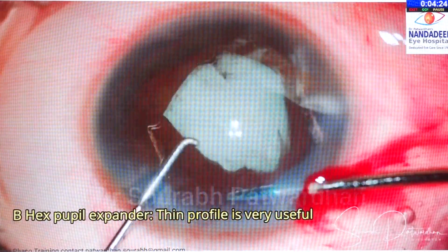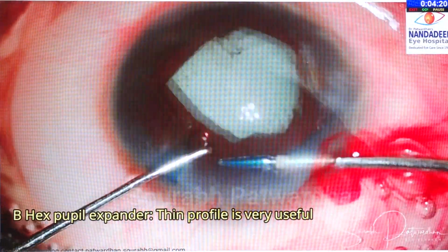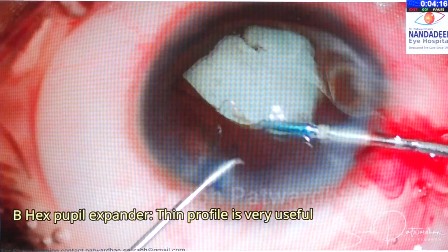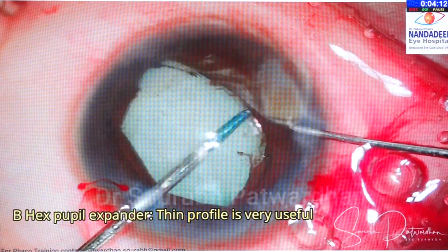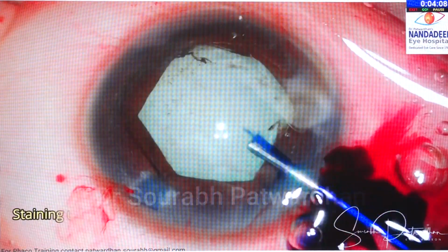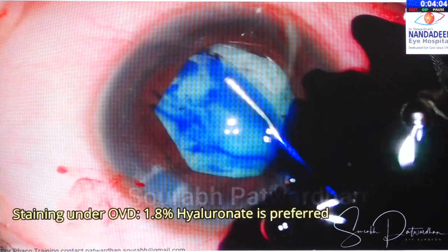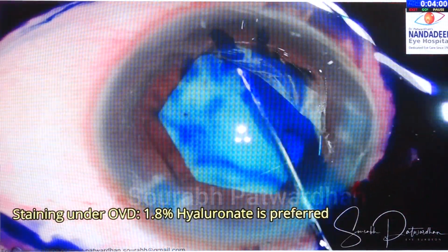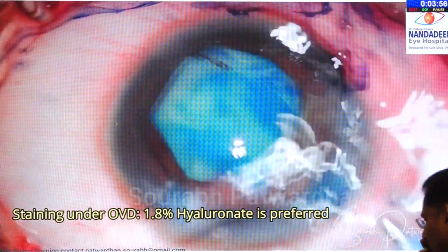Now, once the B-Hex is inside, we have a pupil of adequate size. So that particular problem in the case is now solved. Now you can see the anterior capsule is not well stained, because I could not stain it under the iris. So what you can do is paint the anterior capsule under the viscoelastic which you have used. Of course, it is always better to have a cohesive OVD under which you can stain much better, but it's possible to do under dispersive also.